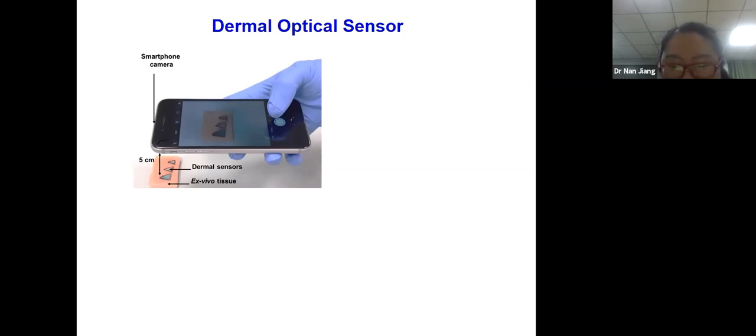For example, the light from the surroundings, the environmental light, will sometimes affect the captured image or the color from the samples. For example, in a dark room or under the sunlight, we can get a different result. So in this case, the engineers need to encode it to eliminate this instability, and they can improve it. I think that they can sort it out in our current method.